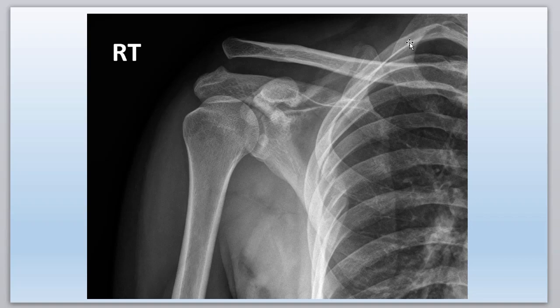Okay, then we have the ribs coming around. Let's check the ribs. So we have another rib coming around like this. Looks good. We have another rib coming around like this. Looks good. Let's count them. There's rib 1, 2, 3, rib 4. Now follow these cortices on rib 4, the up and down borders. So look what we got here. We got a problem, right?